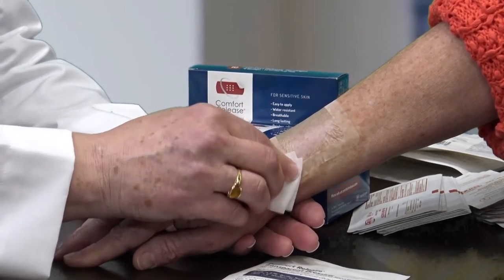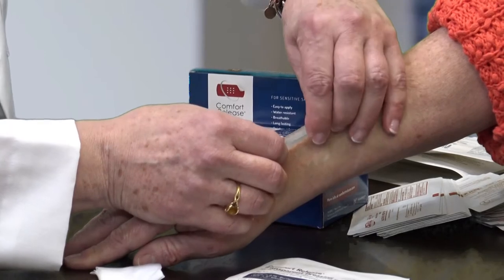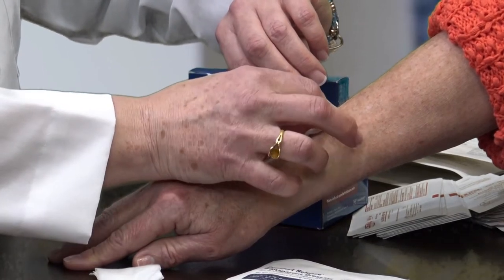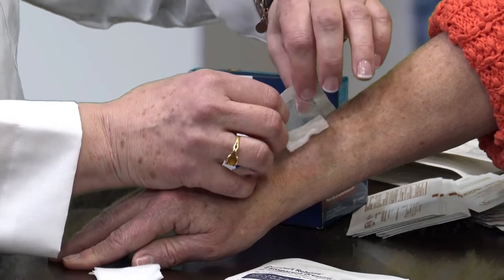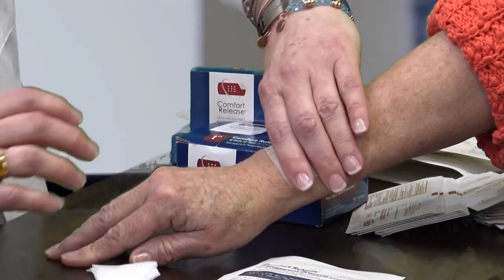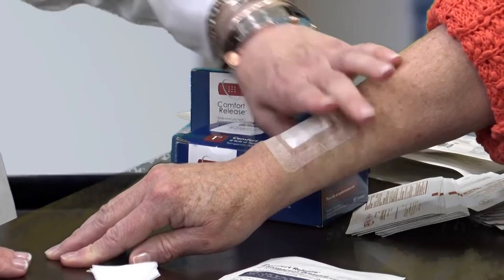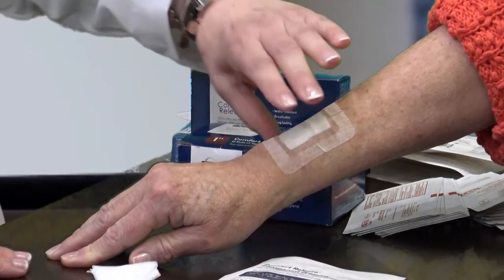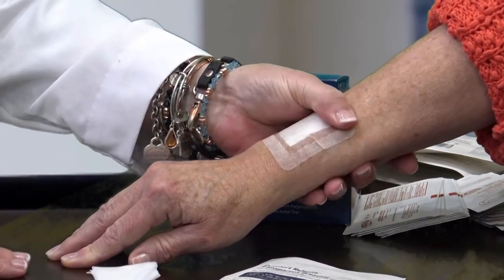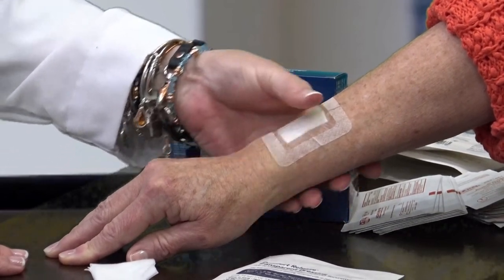We're going to switch off the adhesive, peel back the dressing, and put a more absorbent dressing underneath to deal with the oozing of the skin. We'll allow the alcohol to evaporate and switch the adhesive back on, which will secure the primary dressing in place. The dressing is removable, replaceable, and adjustable, and can stay in place for 3 to 14 days.